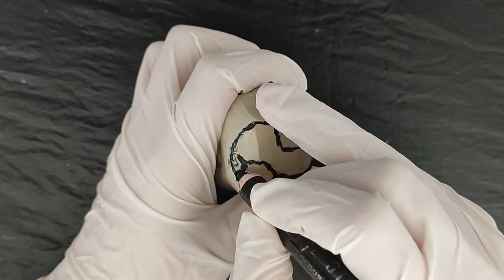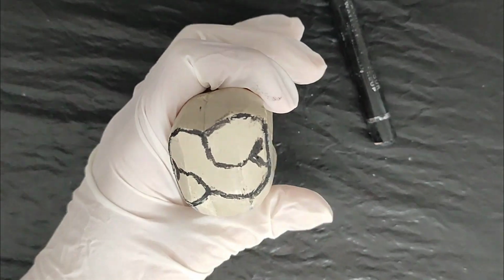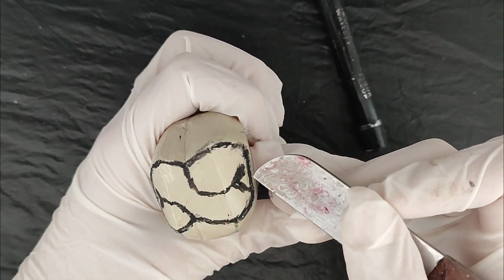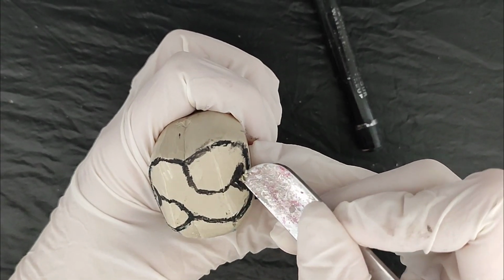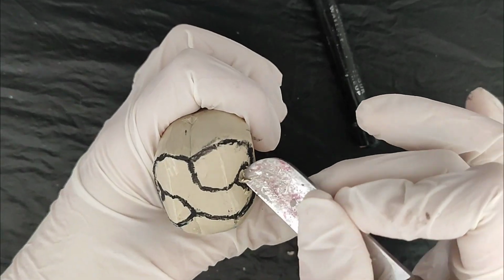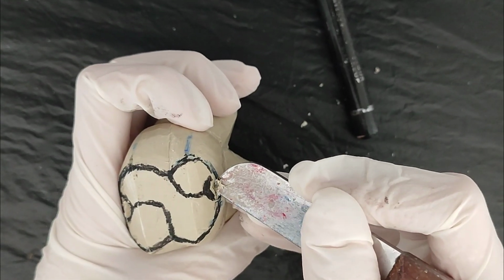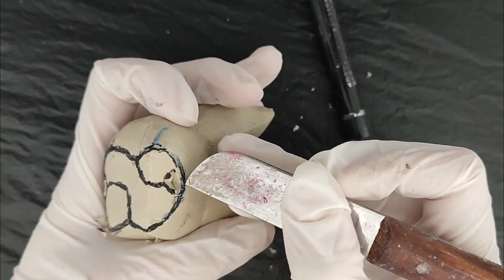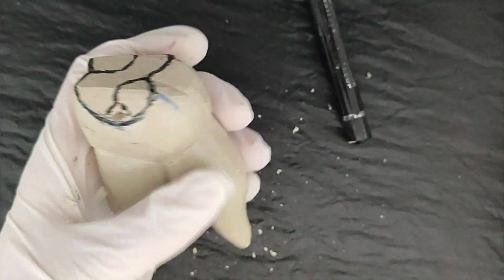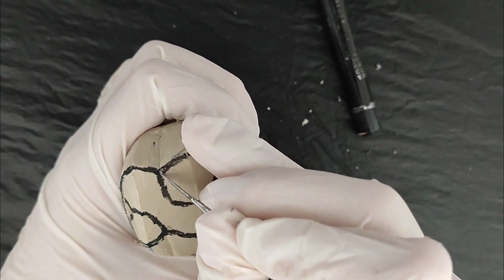Then the lingual groove originating from the lingual side takes a distobuccal direction at the occlusal table and ends in the distal marginal fossa. We will start with the marginal triangular fossa. We will leave 2 mm thickness for the marginal ridge, 1.5 to 2 mm depth, then eliminate the soap. We will create the marginal fossa, which is triangular and limited by the marks already made. In the same way, the distal marginal fossa is created.